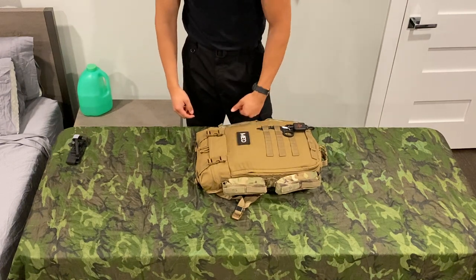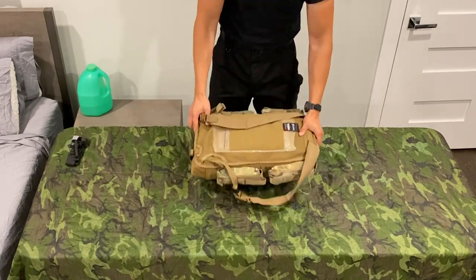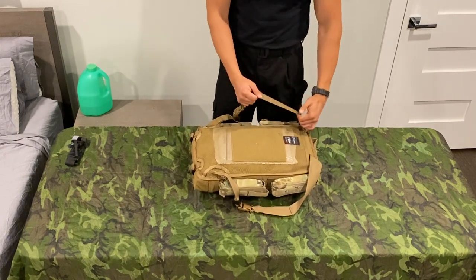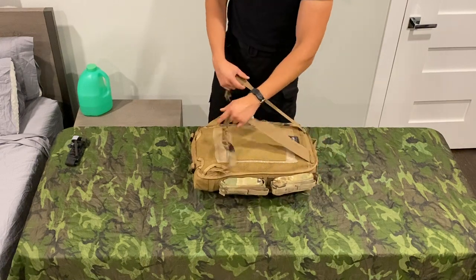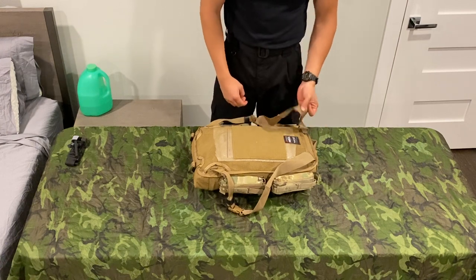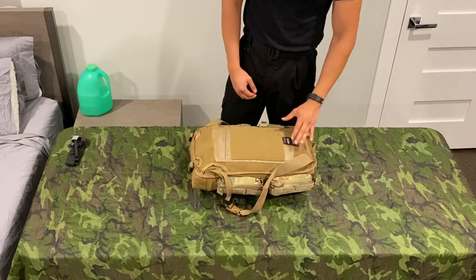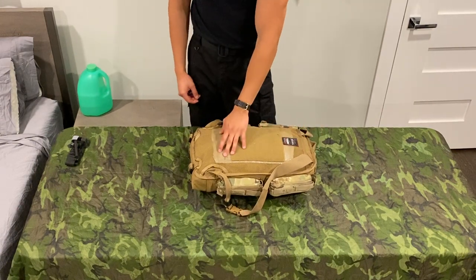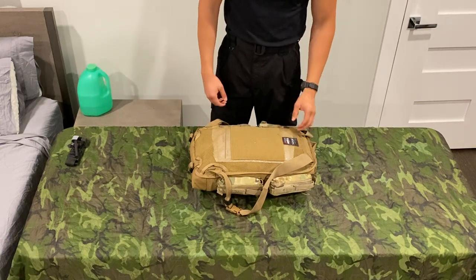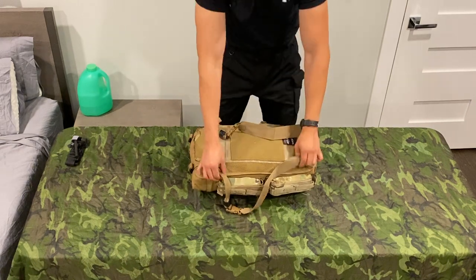Just a reversible med patch here. I do run the flat shoulder straps because I typically wear this with body armor, and these flat webbing straps don't tend to shift as much as the padded ones. If you're going to wear it on its own as a backpack, the padded ones are a great option, but otherwise the flat ones are definitely the way to go. There's a mesh pocket here that a lot of people put SAM splints or C-collars in — I just keep a big trauma sheet for hemorrhaging in there.